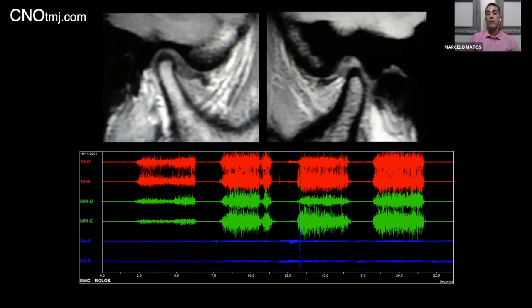Think about systemic causes. This patient may have a problem with insulin, with metabolism of carbohydrates. Think about what the basic fuel of the muscle is: glycogen. And if there is no glycogen, or if the metabolism of glycogen is somehow affected, you're going to have trouble with that. Some muscle relaxants and some drugs also affect it. So it's a very interesting test because it gives you an alert of many things that may compromise the treatment we are thinking about offering to the patient.